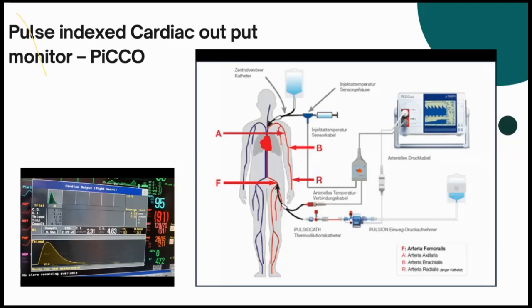So remember the setting. You put a femoral arterial line and you connect it to the thermistor. This is the temperature sensing probe, which goes into this main box here. Then you have the arterial line, which comes through a transducer, and it is connected to a pressurizing bag and taken back to the monitor through a separate transducer. And then you have the cold line where you get the comparison. You get the cold saline and you check the temperature here, 0, how much temperature rise. So that is calculated as a thermodilution technique on the monitor.